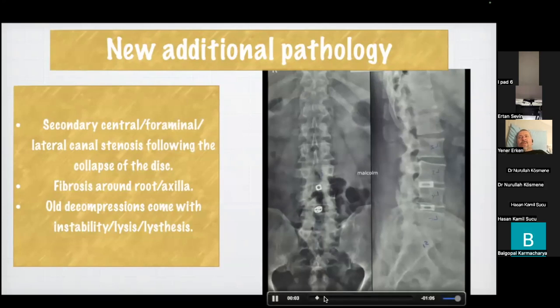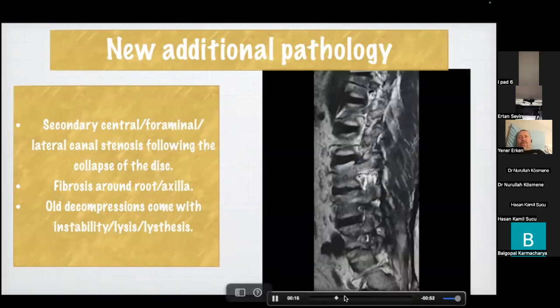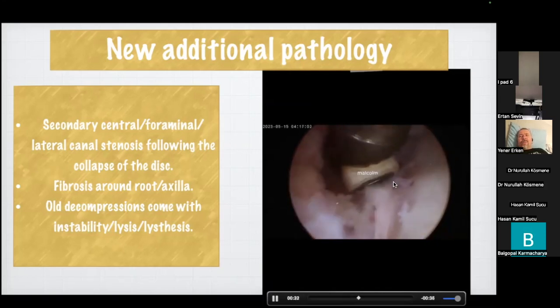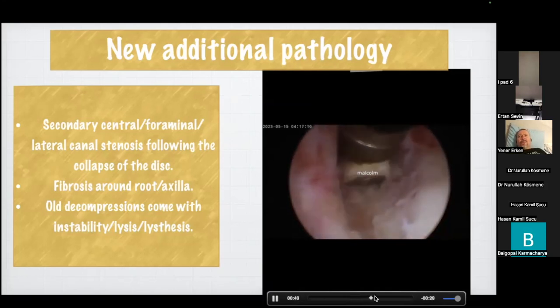So fine. I say, let me go back to the same old path, move the dura away, find the nerve root, undercut the foramen because it's a fused foramen. I can definitely undercut and free the nerve root. So here you see nothing there, fibrosis. And here you can see that I moved the dural surface away. I'm going into the nerve root canal. I'm traversing the full nerve root. I'm freeing. Slowly, slowly, slowly, I'm separating it out. I can see the discal surface below me now.